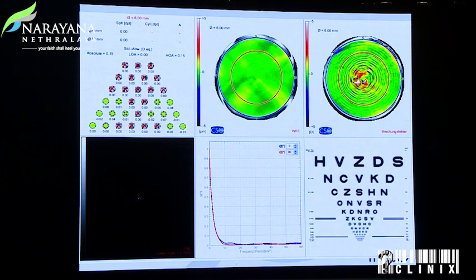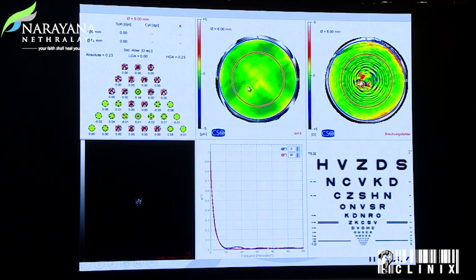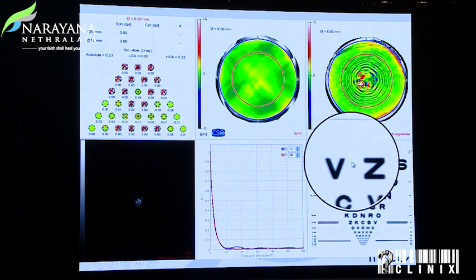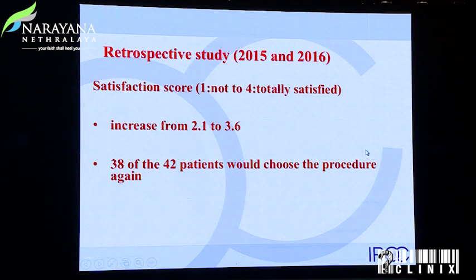And that's why we called it selective wavefront guided treatment: we left the spherical aberration of first and second order alone. You may see here in the center that we do have some stronger power, some spherical aberration in the central area. You can also see that the images are still a little bit blurred, but this is something that the brain can easily compensate.